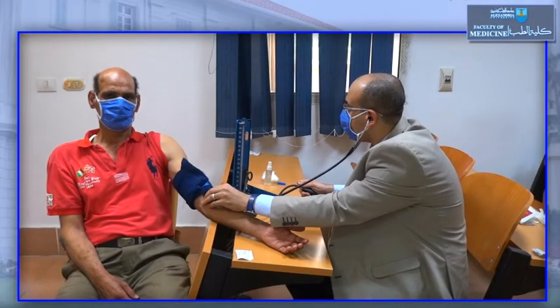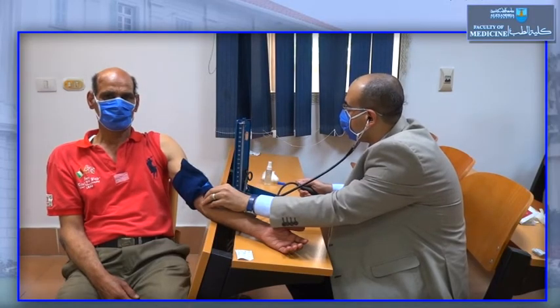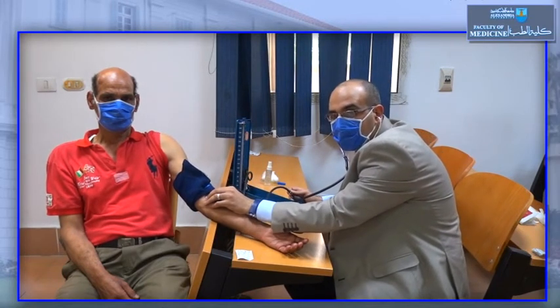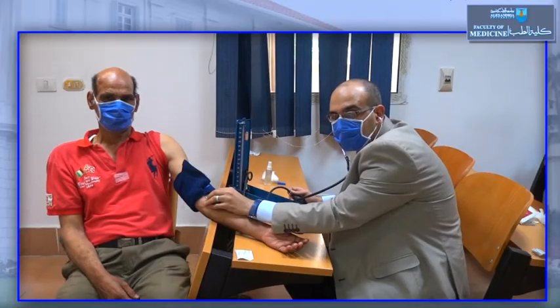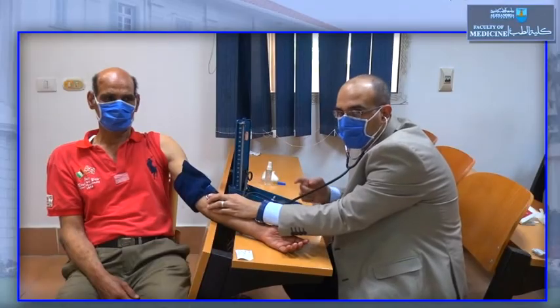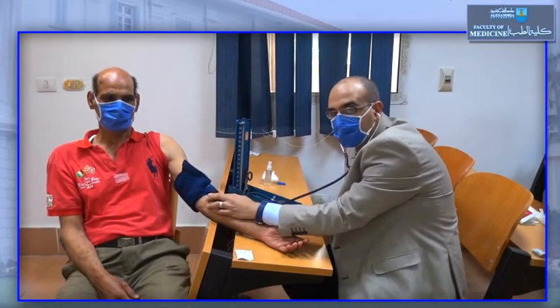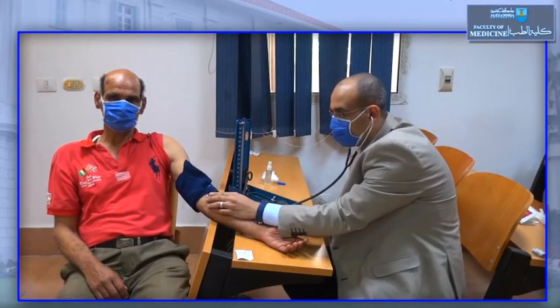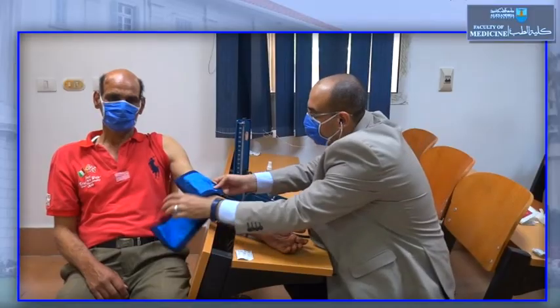The first sound is the systolic blood pressure, and when the sound disappears, this is the diastolic blood pressure. The first sound appeared at 120, and the sound disappeared at 80. So our measurement for blood pressure now is 120 systolic over 80 diastolic. We should measure in the other upper limb, and we should measure in the lower limb, and we should measure after the patient stands for 1 to 2 minutes to detect postural hypotension. This is blood pressure measurement.